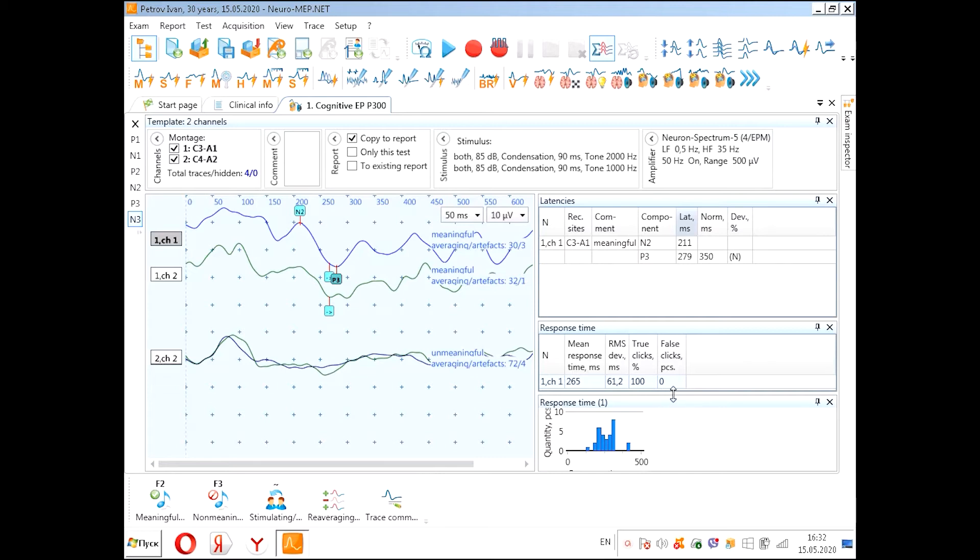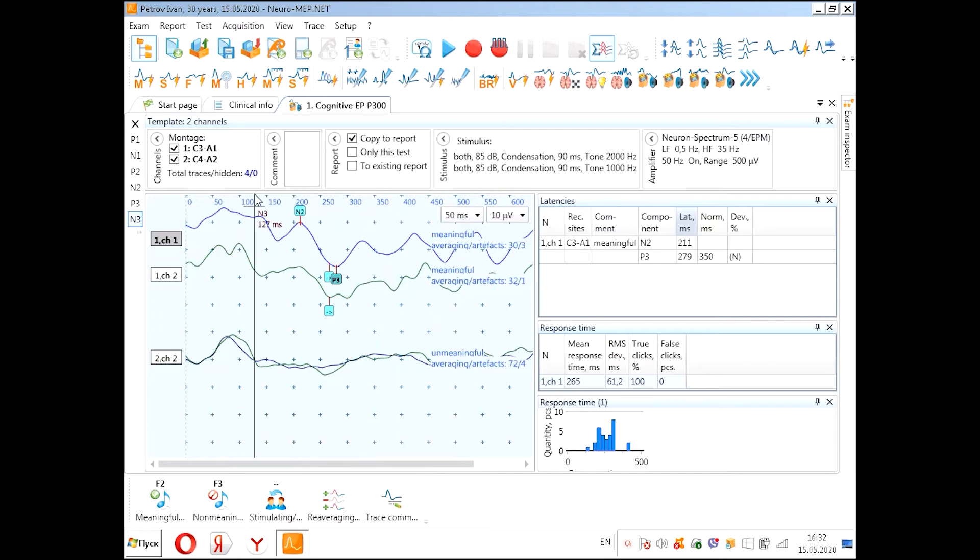And here we see the histogram of response time due to the quantity of our clicks. Now we can save.